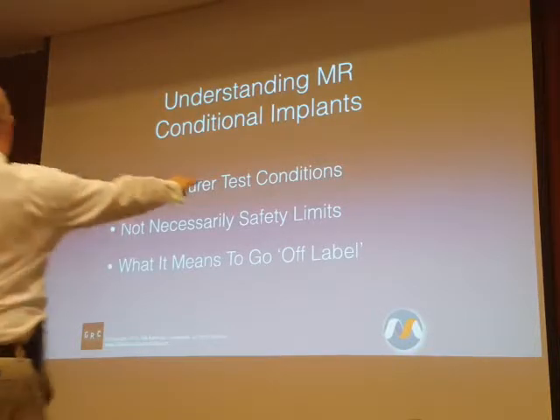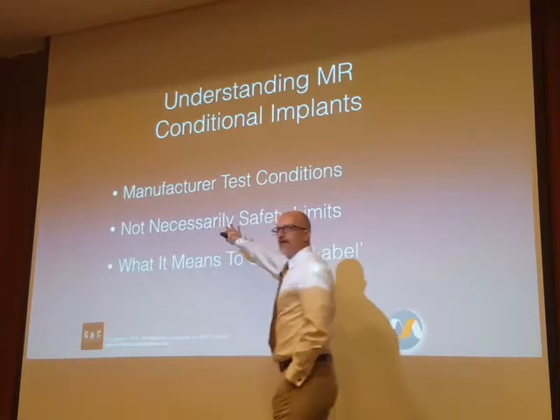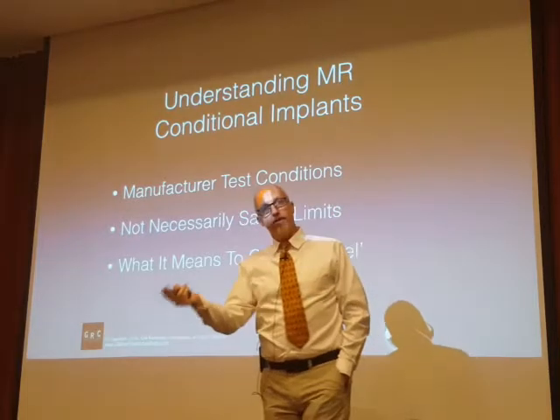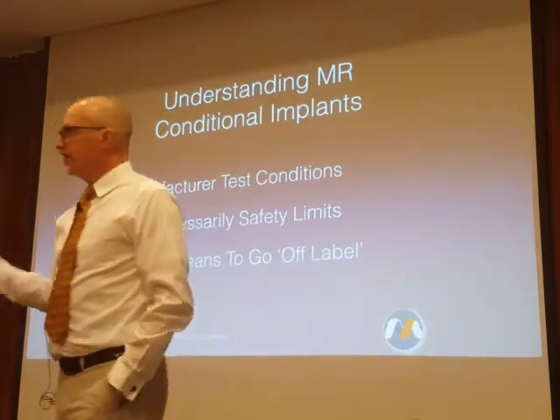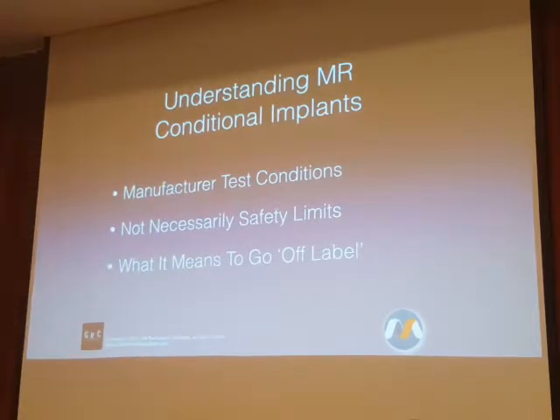So it's important to understand that when you see MR conditional labeling, it is not necessarily the safety threshold. It is the condition under which a manufacturer wanted to have their product tested. It may be so far below any safety threshold that you might be able to double the conditions. You might be able to take those conditions and multiply them times 10 before you even come close to a potential risk, a potential harm.